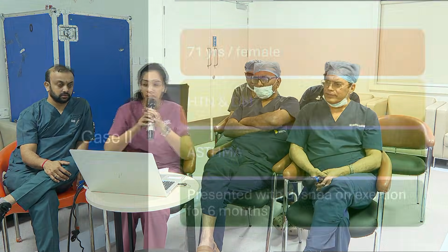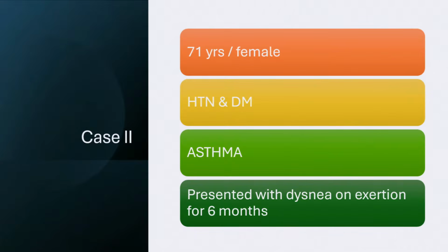Now we will move on to the next case in which we've used a different platform compared to the first case, and why we've done that I'll be explaining. So we had a 71-year-old female who was quite frail. She was asthmatic, hypertensive and diabetic, and presented with breathlessness on exertion for the last 6 months.